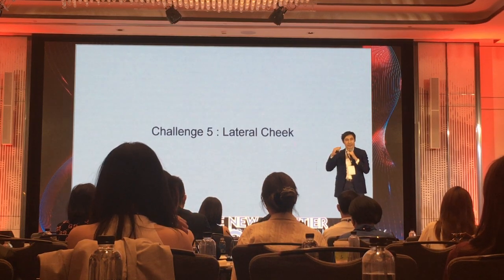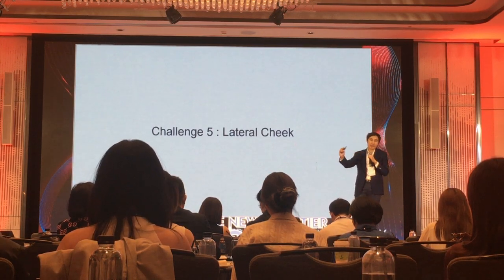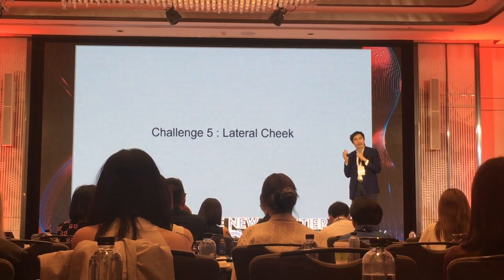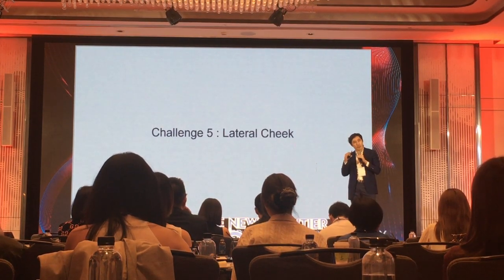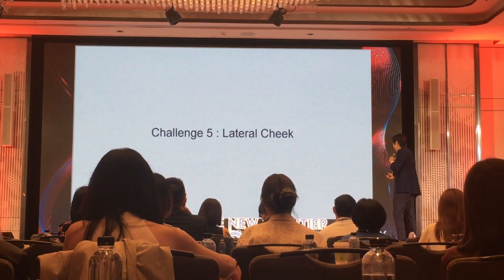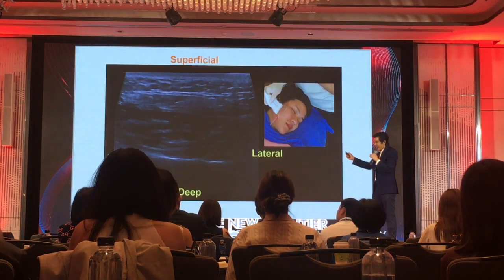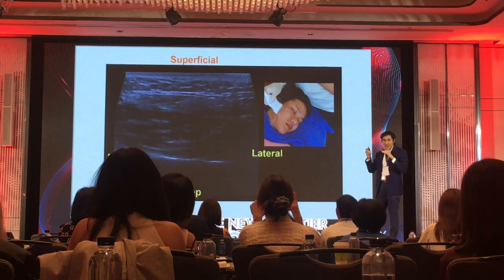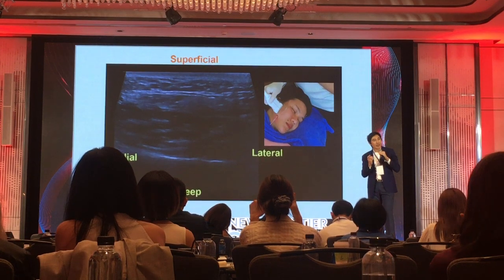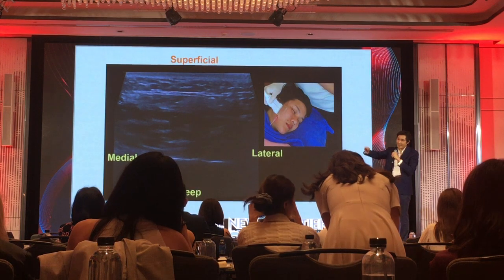Because it's more shallow, more superficial than you might think, and the consistency of the parotid is just like the superficial subcutaneous fat. You cannot discriminate between the two planes with your hand. It's not quite obvious to distinguish them. So use ultrasound to insert the thread into the sub-SMAS plane, but not penetrate the parotid gland, which is the pre-parotid space, the space between the SMAS and the parotid gland.